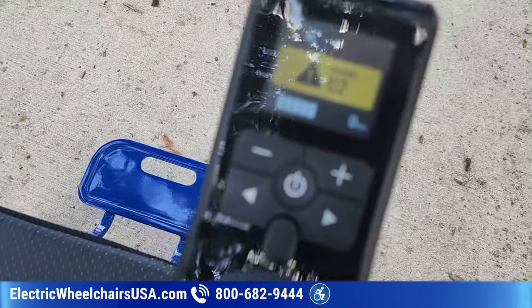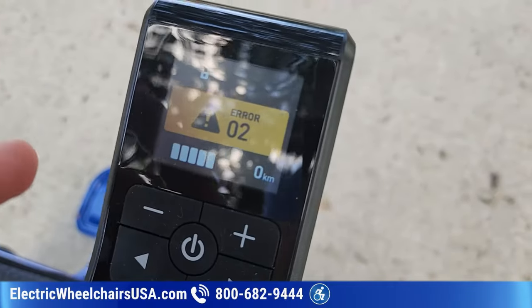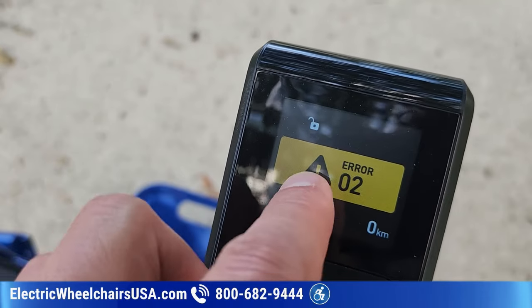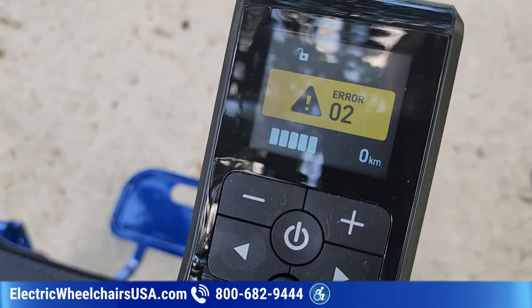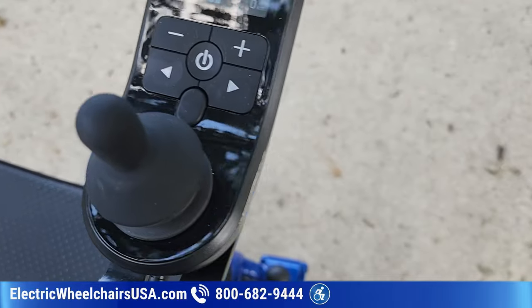you'll notice there's an error code here. It says error code 2 on the joystick. Now the manual that comes with this shows any of these error codes that come up. There's different numbers. It'll tell you exactly what you need to do to fix it. So very nice troubleshooting. But right now, you can't operate the chair because it's in manual.